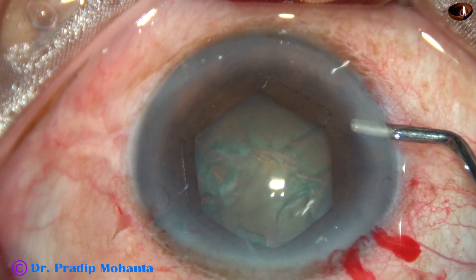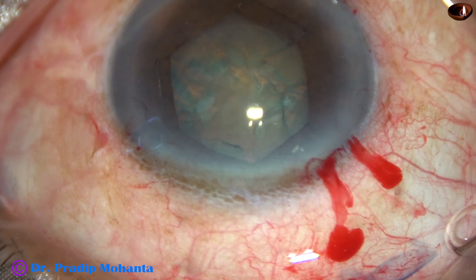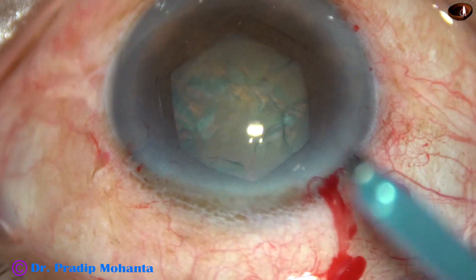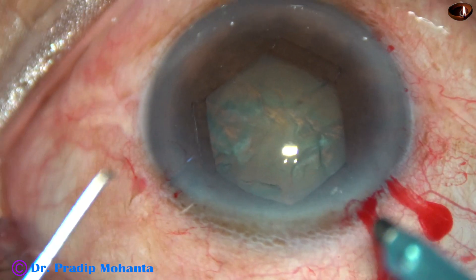Now see, the pupil has taken a beautiful hexagonal shape. Now let us proceed with phaco.